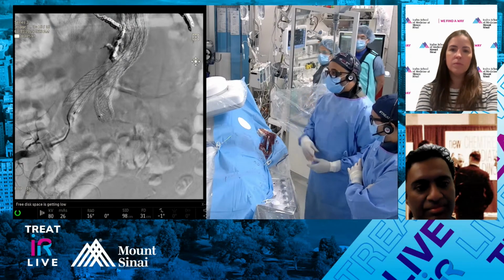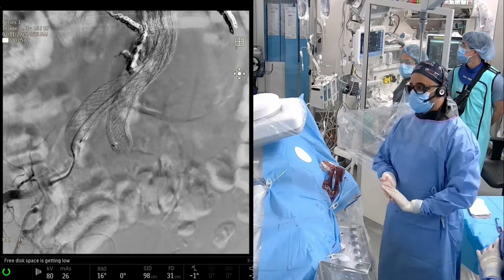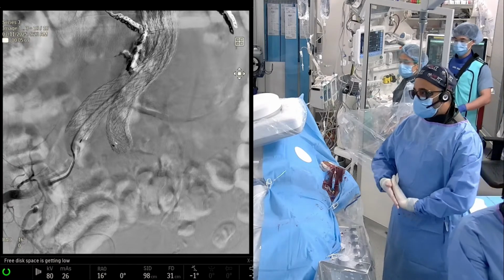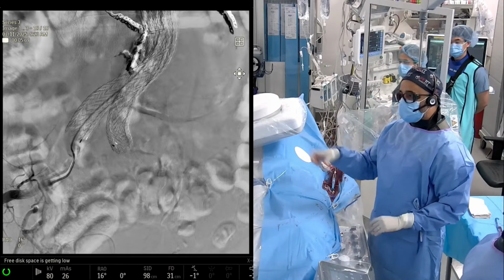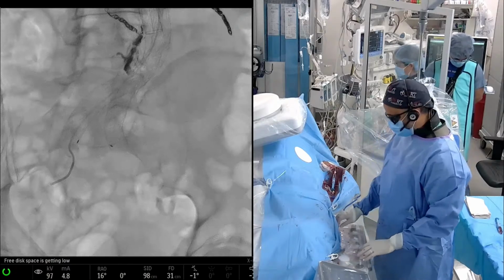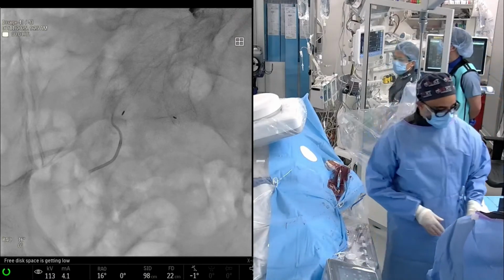Yeah, so the coils for Penumbra are sized a little differently. They're supposed to be 1-to-1 sizing for the pods because it's a relatively stiffer coil. So we're going to take an 855 pod. There is an 870. The only reason is I don't have a ton of experience, and it's not a super long hypo, so I'm a little worried about the length. I can always put an extra coil, but it's really hard for me to shorten the coil. So we're going to try an 855 and see how it goes. In reality, I'm hoping that it just takes 1 or 2 coils and we'll be done.